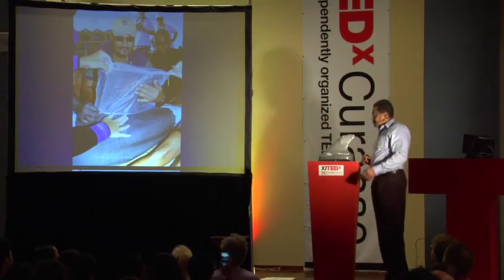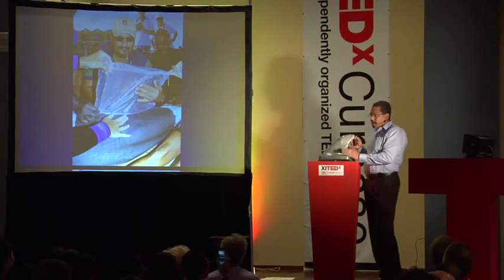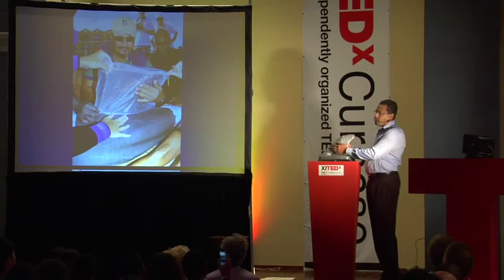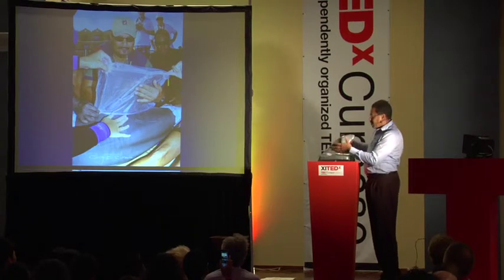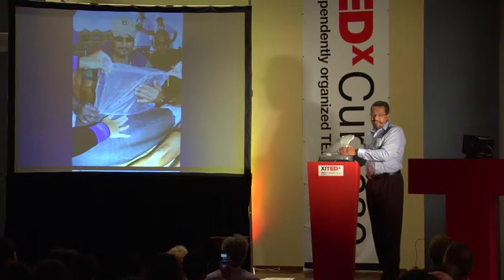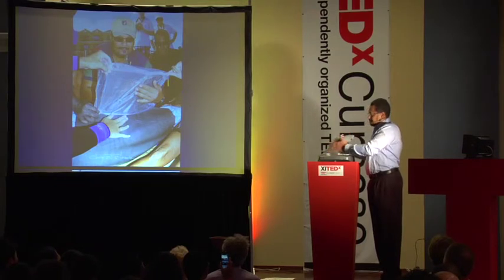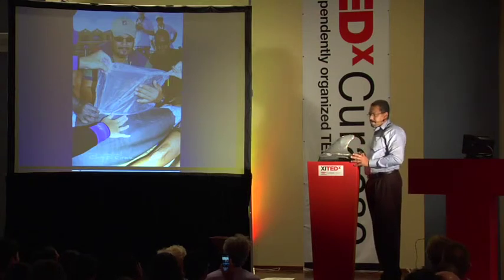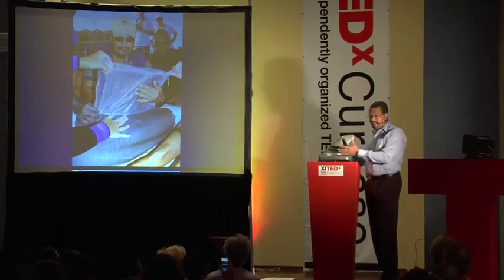Okay, so here you have the actual mold, and you can see with a shape like this, you cannot go around it, you can't wrap around it. So first, we had to bring the two sides of the wound together, because they were falling apart. But you can't wrap. So I used a self-adhesive plastic material, so I could pull the two sides of the wound together. I had leftover on the sides, which I could trim. And then I was ready to start making a plaster mold, because I needed to have the exact shape.